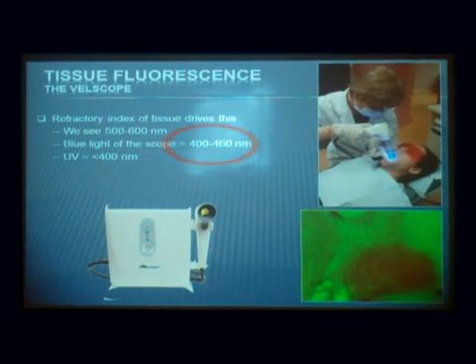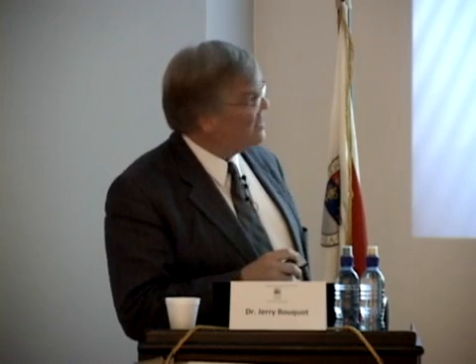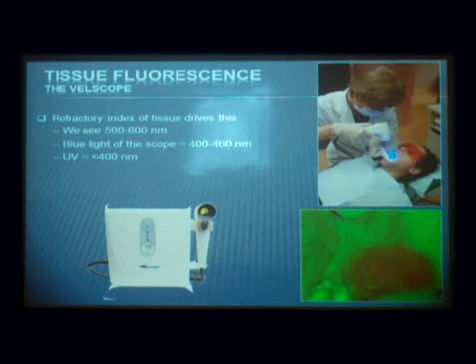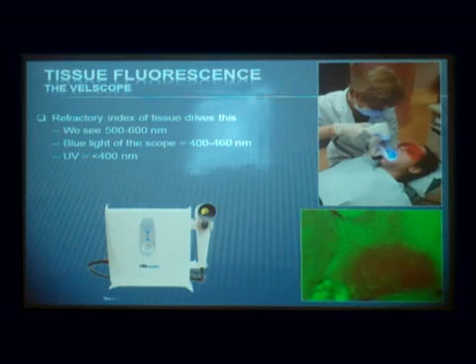I'm not sure we're quite there yet, but we try to get light in the blue spectrum. It's not near infrared, near ultraviolet, really. And then the blue light, with the first product that came out, it's a Canadian company. Lots of good research. They got $15 million from our government to do their research. It's never happened before. A foreign scientific research project, totally funded in another country, and that's how much the NIH believed in this technology.